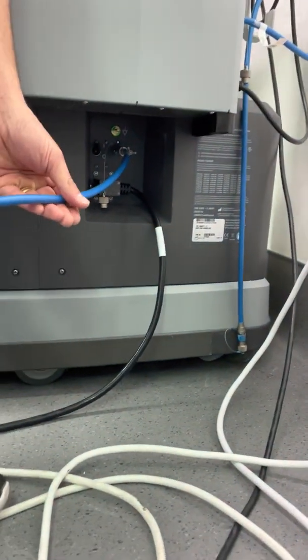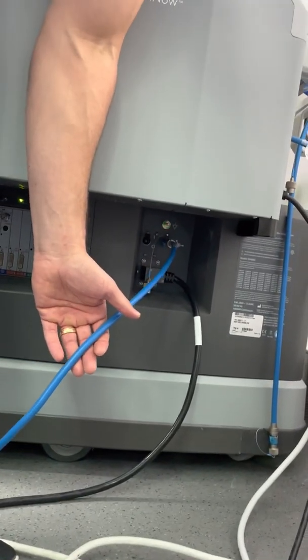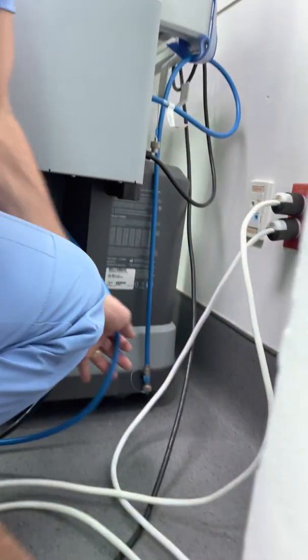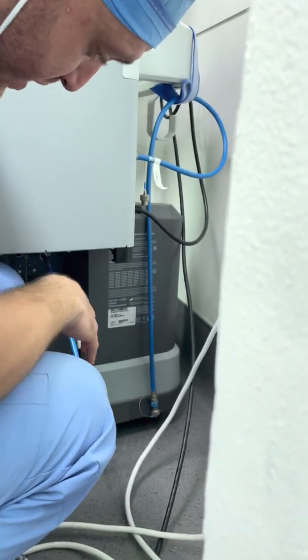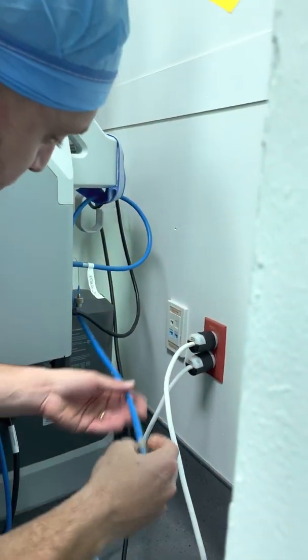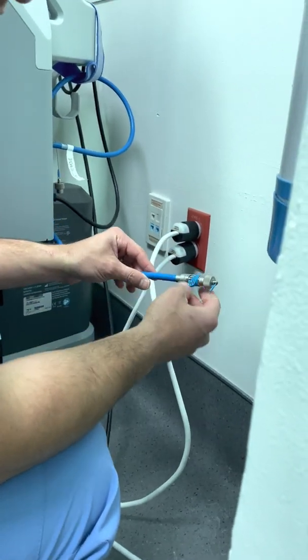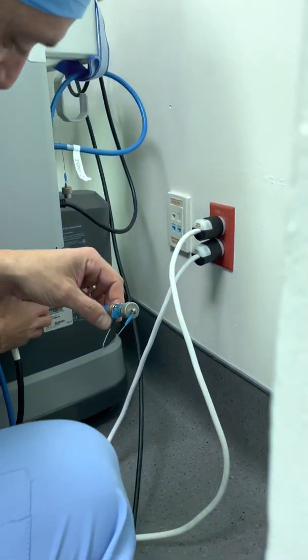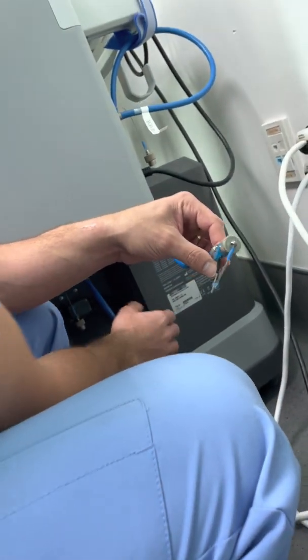These are the blue fiber optic cables that interconnect all the systems. What you're going to have to do is change out some of these cords from the system, and switch out to the simulator. This little short three-to-four foot cord from the simulator is what we're going to connect now to the surging console.